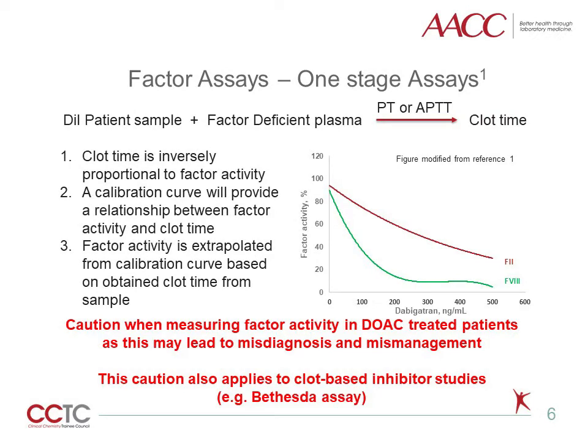The one-stage assay is the most common method used for determining factor activity. Factor-deficient plasma is added to a dilute patient sample, then either a PT or APTT is run in order to obtain a corresponding clot time. The clot time is inversely proportional to factor activity, so the shorter the clotting time, the higher the factor activity. A calibration curve with a standard of known factor activity will provide a relationship between factor activity and clot times. As DOACs may increase PT or APTT clot times, this will result in a factitiously low factor activity, as noted with increasing concentrations of dabigatran and reported factor II and factor VIII activity. So caution must be exercised when performing factor activity testing in DOAC-treated patients, as this may lead to misdiagnosis and potential mismanagement.